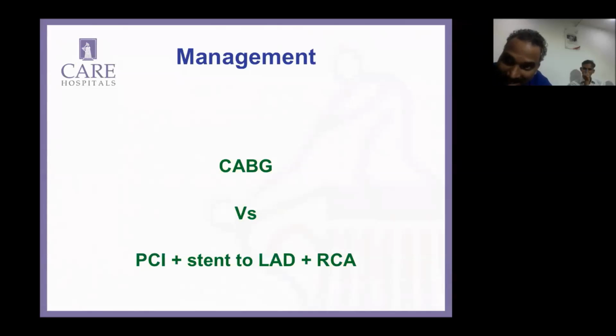See, these grafts, and I'm surprised, only the right graft is there. There were no grafts given to the left side. So, yeah, it's okay. And second, whatever we have discussed, that competitive flow is a very important thing which we have to do in conventional angiogram. Many times, if I don't see a competitive flow in a vessel, and if I don't suspect any total occlusion, I accept that the graft is gone in conventional angio. In these 5 years, I came to that conclusion. I accept the graft is gone, like in this case.